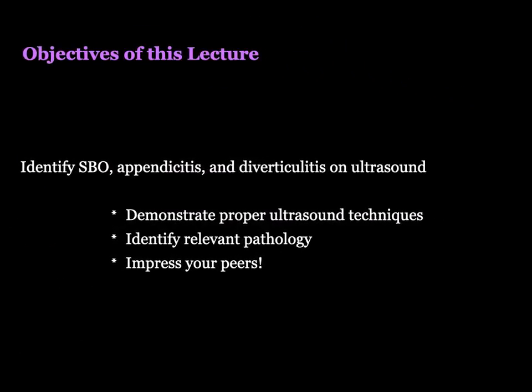The objectives of this lecture will include the identification of small bowel obstructions, appendicitis, and diverticulitis on ultrasound, demonstrating the proper ultrasound techniques, having you identify the relevant pathology when you're performing the examination, and being able to impress your peers with your excellent sonographic skills.